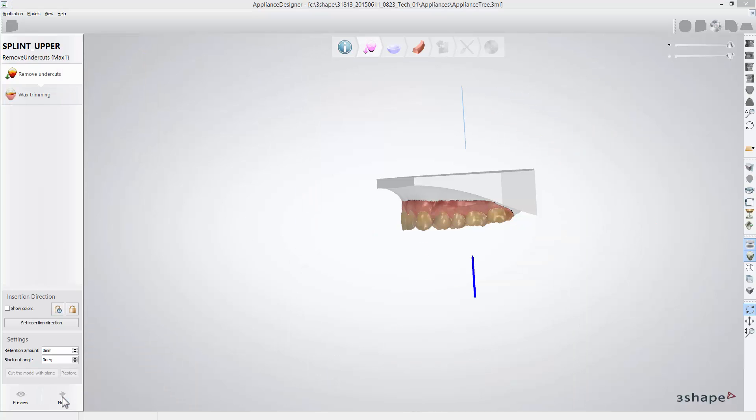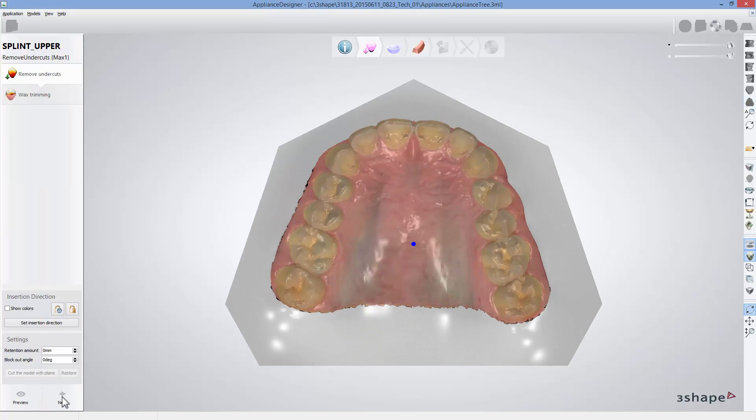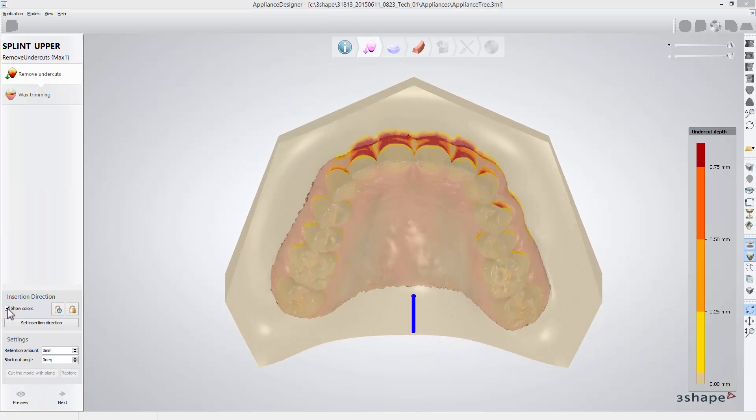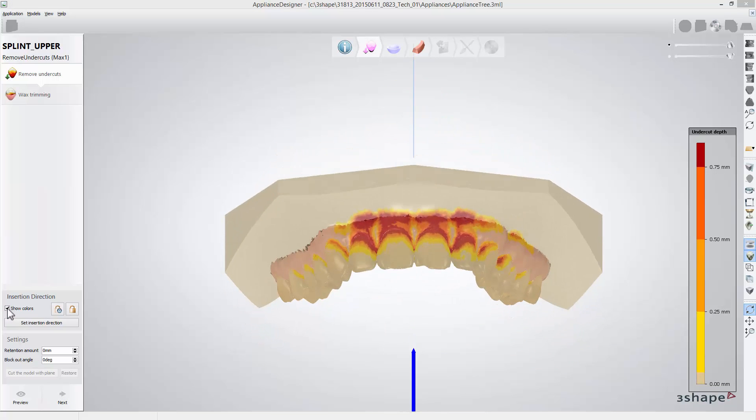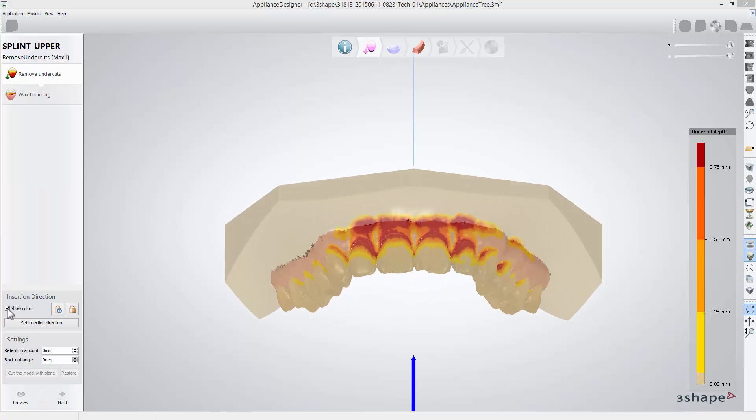In the remove undercut step, the insertion direction line will appear and will be set according to the plane. If you select the show colors box you will visualize the undercuts blocking areas. At this stage you can adjust the insertion direction.